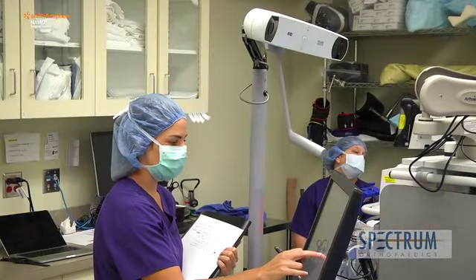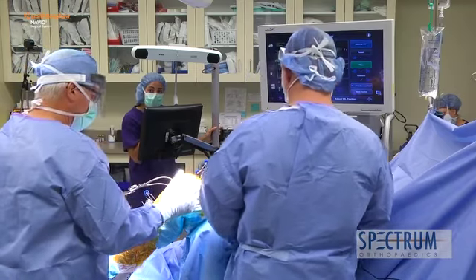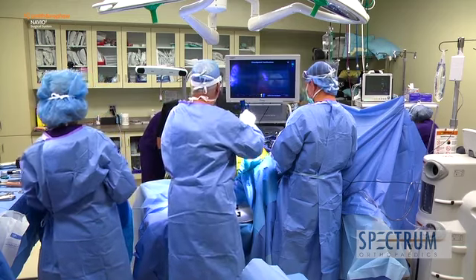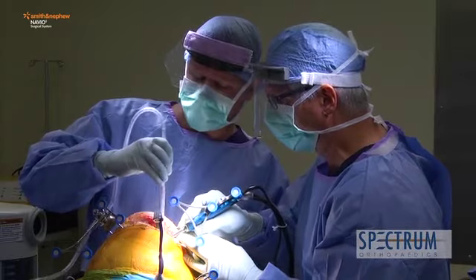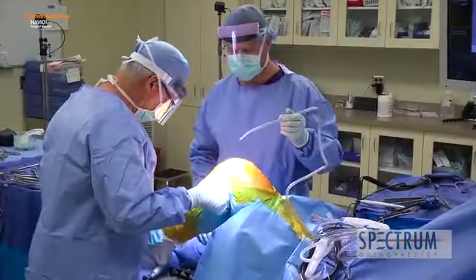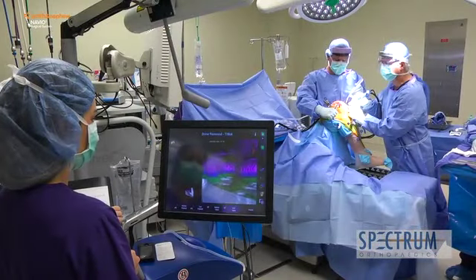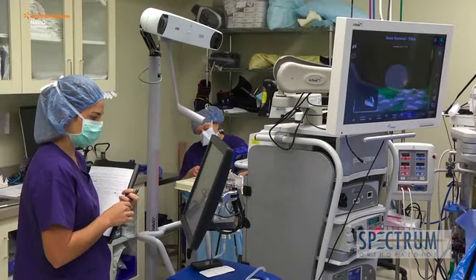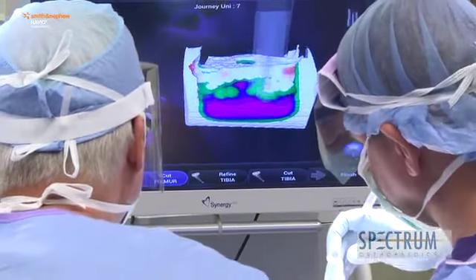It's allowed us to actually map out the entire knee, or in the case of a partial knee replacement, the affected part of the knee, to be able to give us exact measurements so we can fit the knee as best possible. And then once we've put the knee with the best possible fit, that allows us then to make sure that we have it balanced properly. For knee replacements, the balance of the ligaments dictate the wear pattern that the prosthesis is going to have, and then we actually are just resurfacing it.